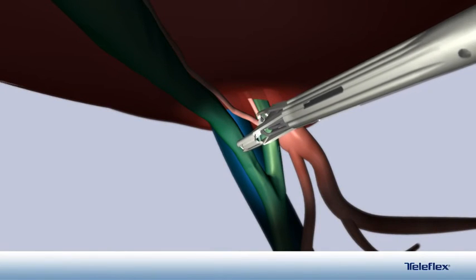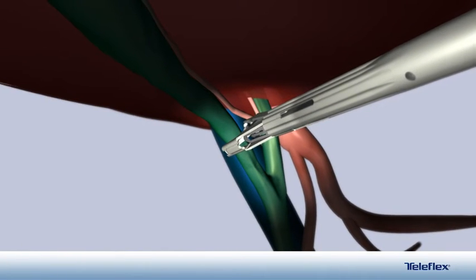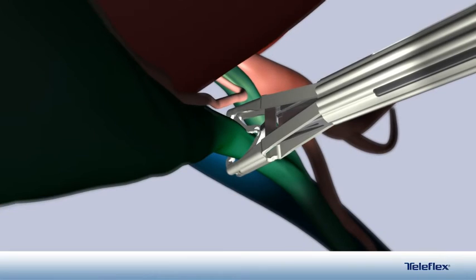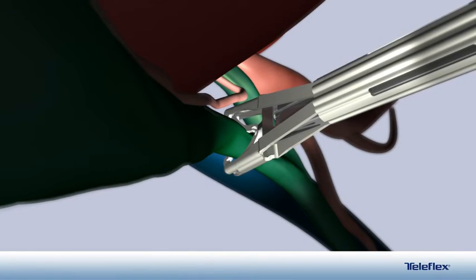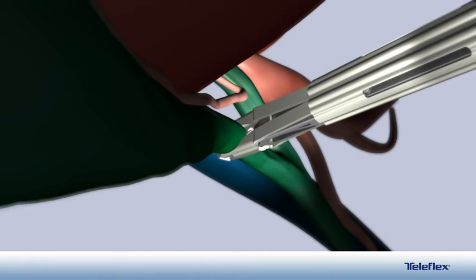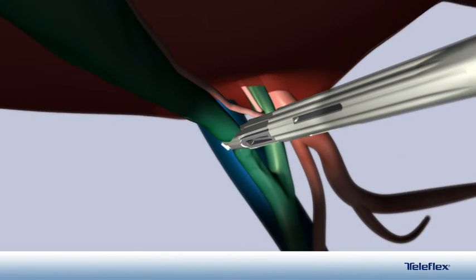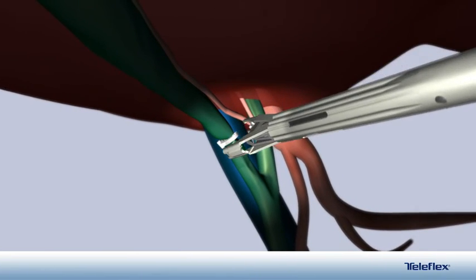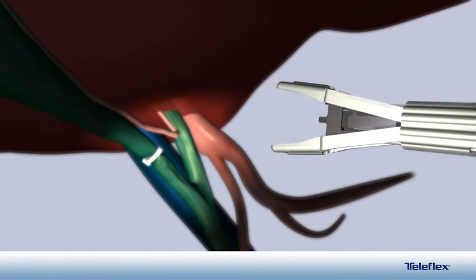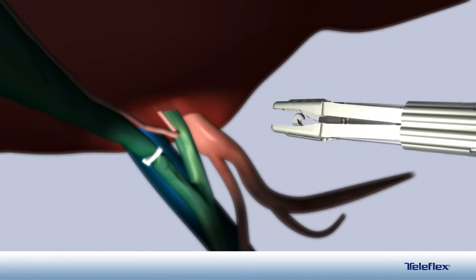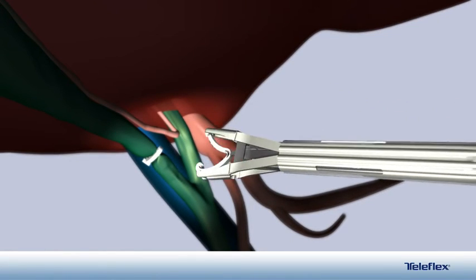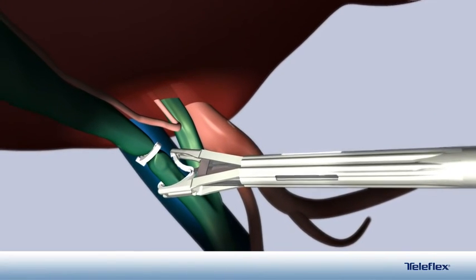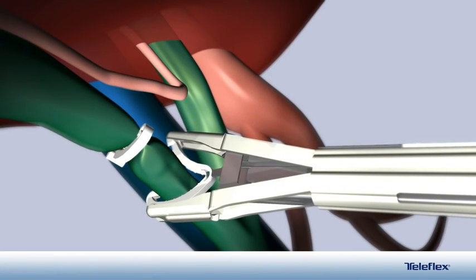The surgeon places the clip across the cystic duct near its origin from the gallbladder. The surgeon confirms the clip is completely surrounding the cystic duct and then locks the clip. At this point, the surgeon removes the jaws of the applier from the structure prior to loading another clip. Note that the clip is not loaded into the jaws of the applier while touching the underlying structure. Clear visualization of the clip around the structure is the key to achieving a secure lock.